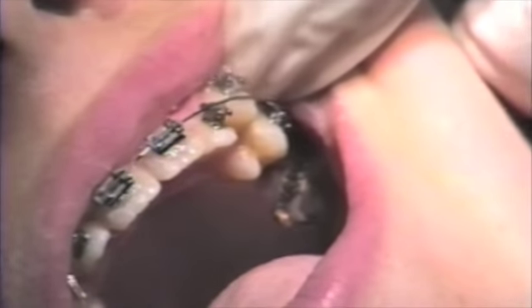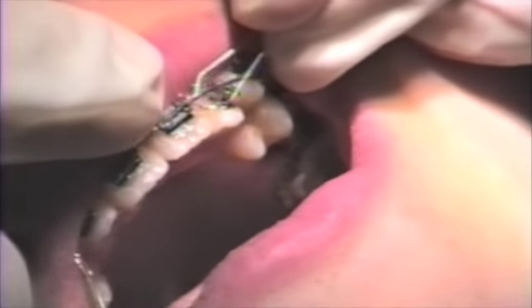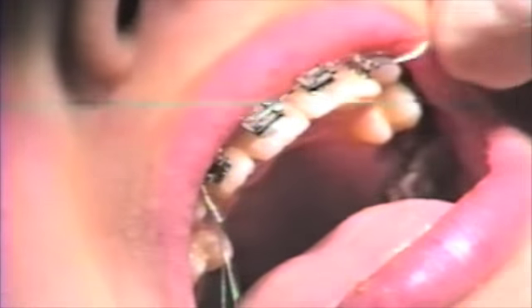Now we will go to the other side. Looking at the lateral incisor, we will be positioning the arch wire for a 4-tie wing tie. Engage the bracket with the ligature wire, using a curette sometimes to obtain the full engagement in the tie wings. In this case, we will be making the pigtail on the distal since that's where the wire needs to be held the tightest.